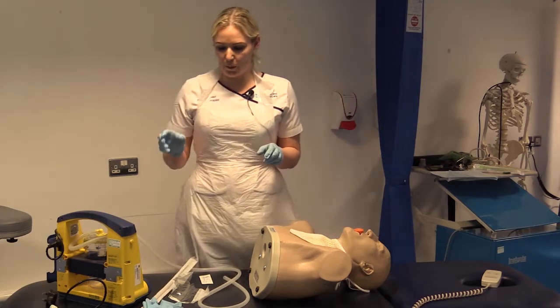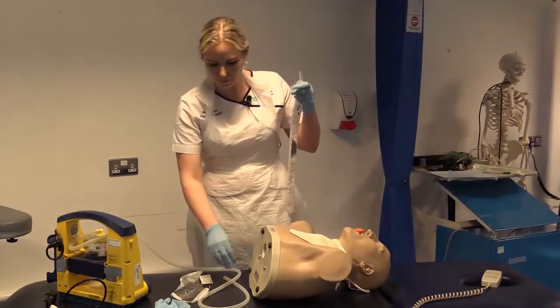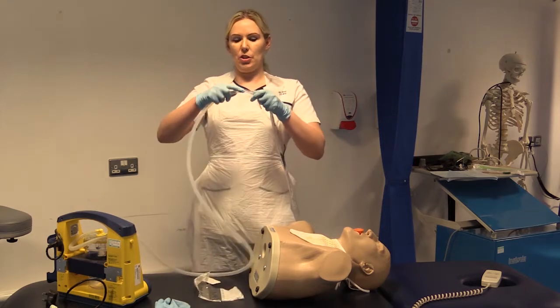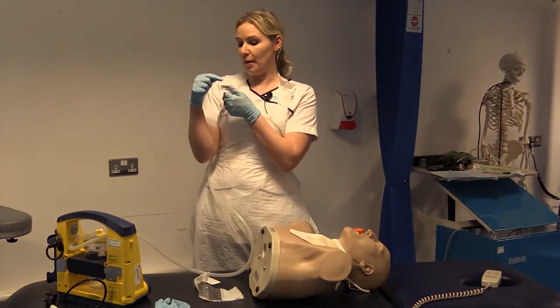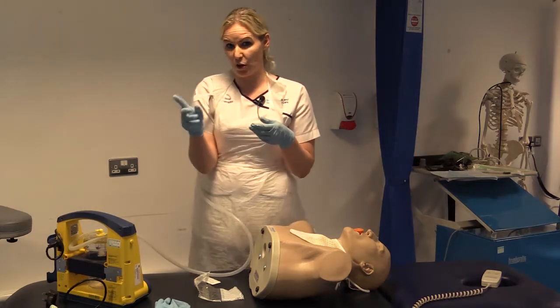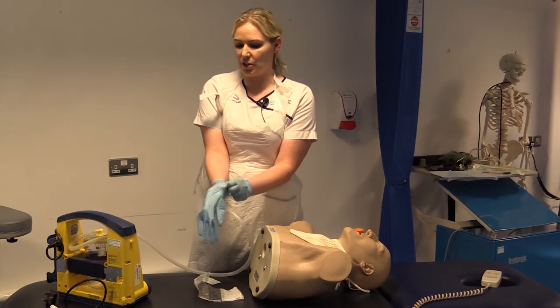Now we're going to choose our appropriate sized airway, and attach it into our suction tubing, just by opening again at the top, keeping the rest of the catheter in the plastic sleeve. We're going to insert into our suction tubing and pop that in under our arm. Again, you can apply another thin layer of gel on the inside of your plastic sleeve just to aid insertion of the catheter. At this point we're going to add our second glove, and this is going to be our clean hand and the only hand that touches the catheter.